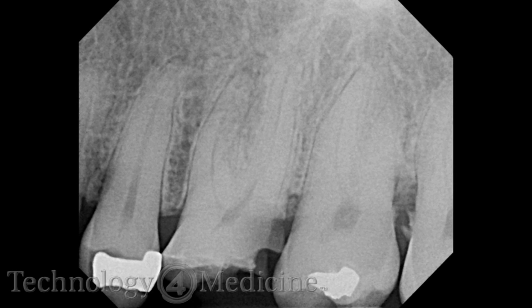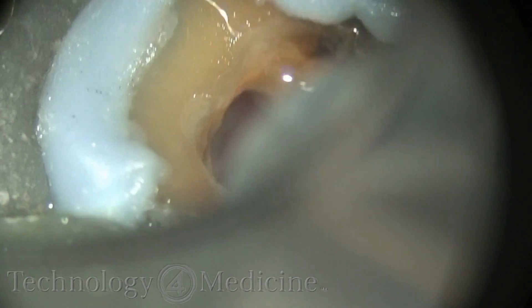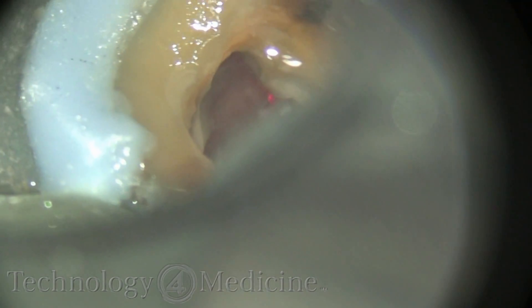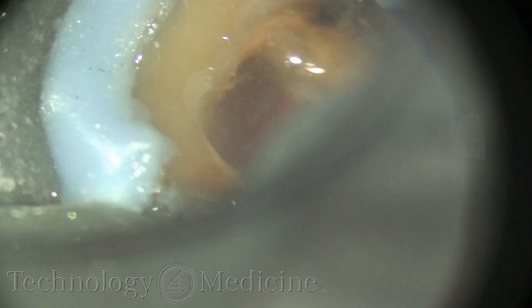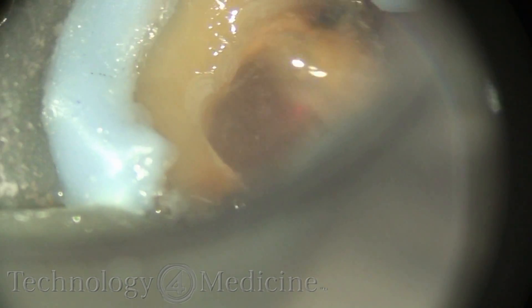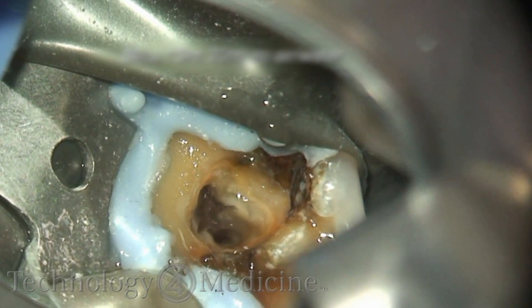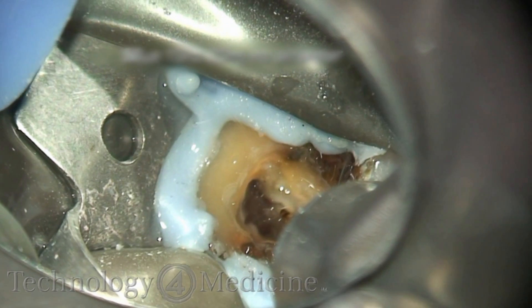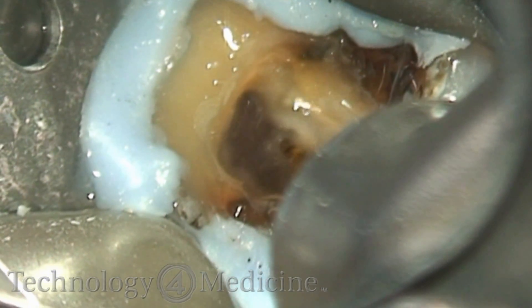Here's a case showing more PIPS — upper left molar, using the PIPS tip for the power lase, placing the tip into just the orifice, cleaning out the mesial buccal 2 and watching the material flow out of the mesial buccal 1. You can see the entire chamber moving. When we've done this before on clear teeth, we're in one canal and can see the photoacoustic streaming action in other canals while we're not even close to those canals.